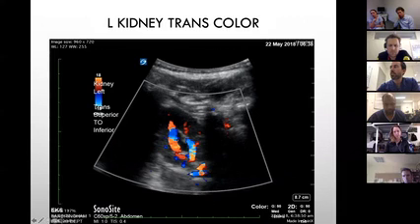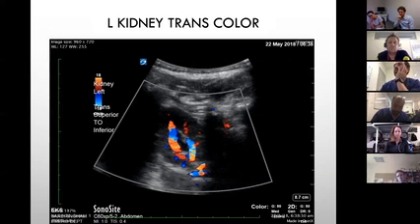But the idea of showing this one is not actually trying to show where the directional flow is. Is that, on a quick look, a flow, first of all? And is this image primarily showing we are in the mid part of the kidney, rather than what the actual flow dynamics are? Okay, thanks. Yeah, you might have to adjust the scale. I totally agree. Yeah.